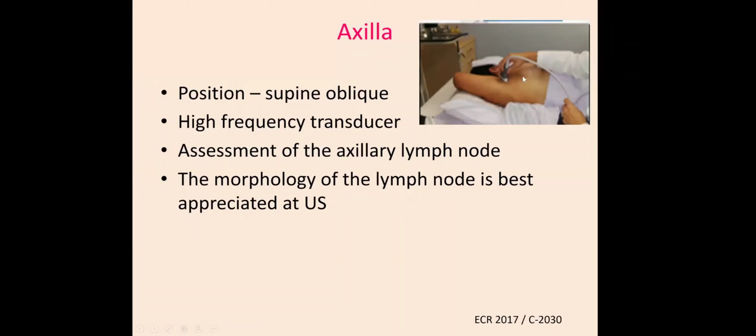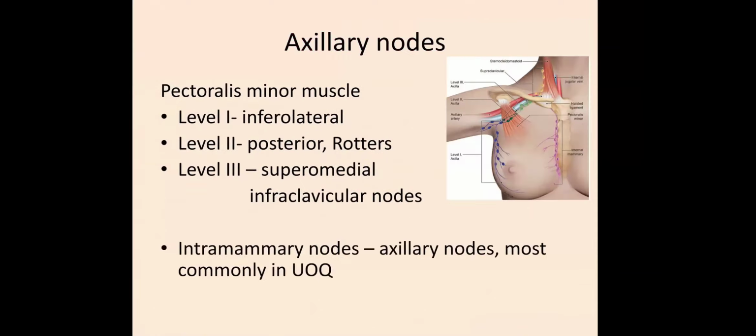One of the main indications for doing axillary ultrasound, if you're doing breast ultrasound, is for the assessment of axillary lymph nodes. As you're well aware, the detection of any suspicious axillary lymph node would change the staging, diagnosis, and prognosis of the patient in the case of carcinoma breast. And the morphology of the lymph node is best appreciated on ultrasound rather than mammography and MRI. So ultrasound is actually the investigation of choice to evaluate the axilla.